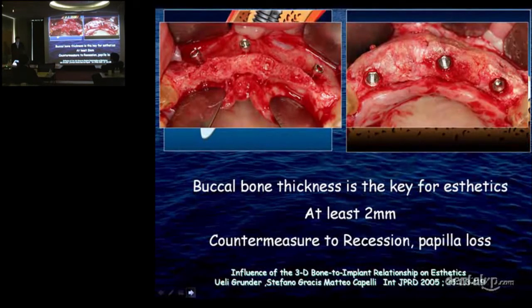Furthermore, he supposed that in neighboring implant sites, sufficient bone thickness on the buccal side could support the buccal portion of the inter-implant papilla. Ultimately, both soft tissue and bone tissue should be thick enough to maintain tissue continuity and provide an aesthetic tissue frame.